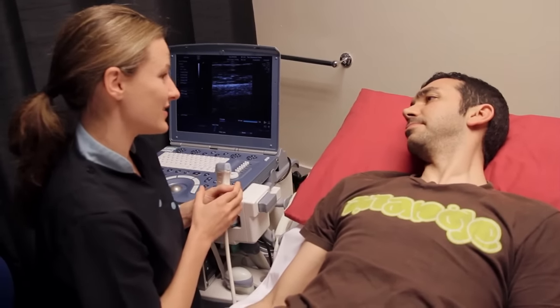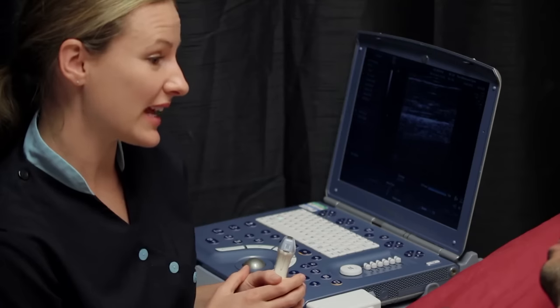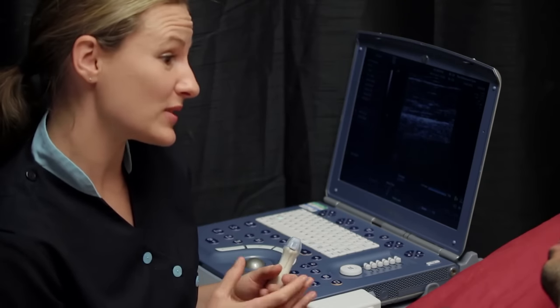Ultrasound gel is placed on the patient's scrotum and the testicles and epididymides are scanned with an ultrasound probe.